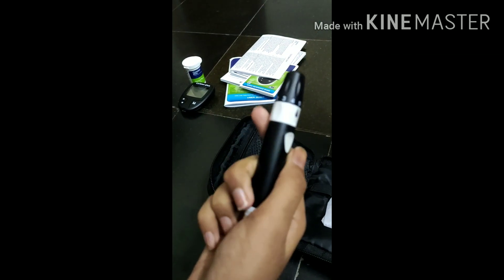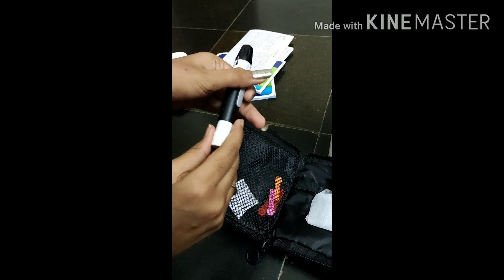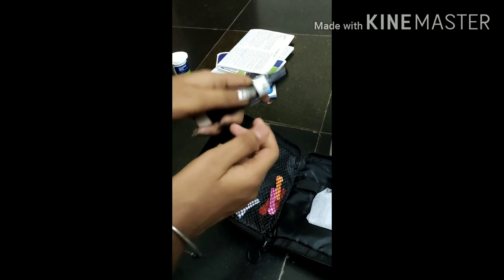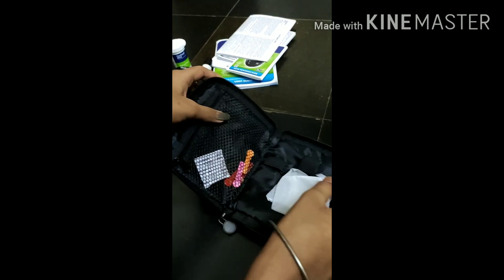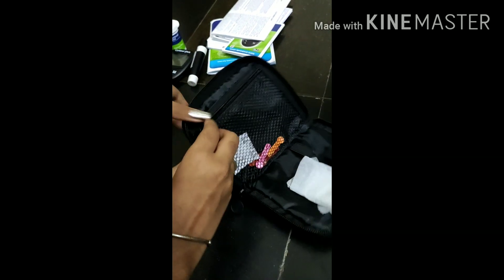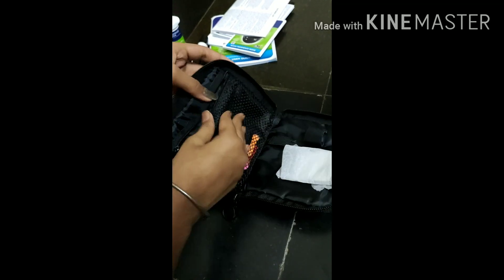Next we have the lancing device. I will show how to use it. You should drag it like this to open it, and you should clean it. Next you have some alcohol wipes, which are used before testing to clean your hands.